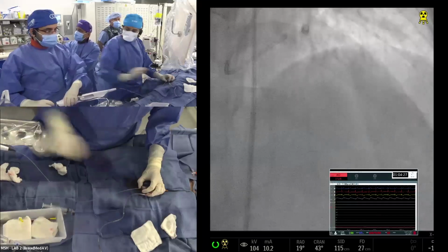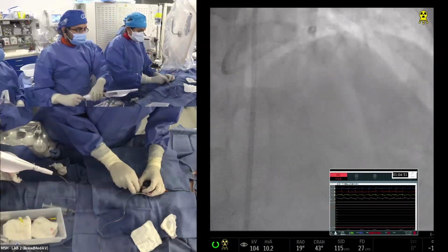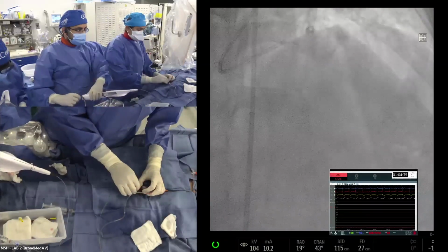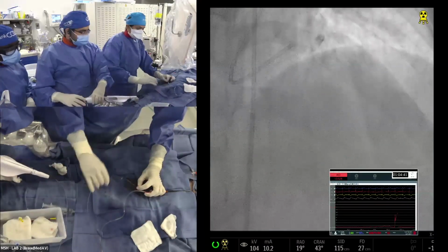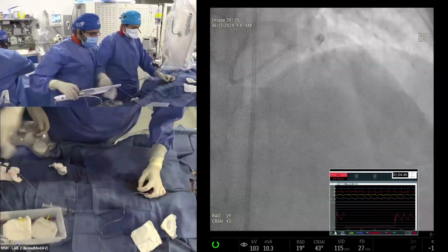If lesions remain good. Remember, in the drug coated balloon era, in about one third of cases you have to do a bailout stenting. So in this particular case, it's a calcific, very tight lesion. If it's not good, then we will take away the agent and put a second stent. But if it looks good, no. Cutting balloon here.